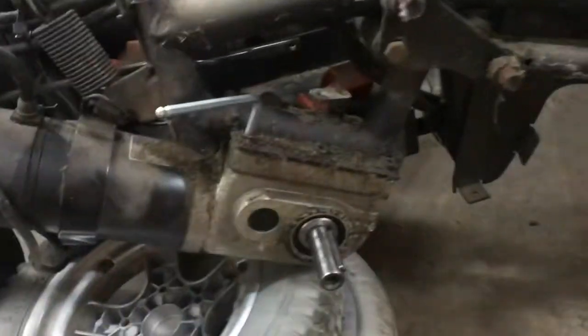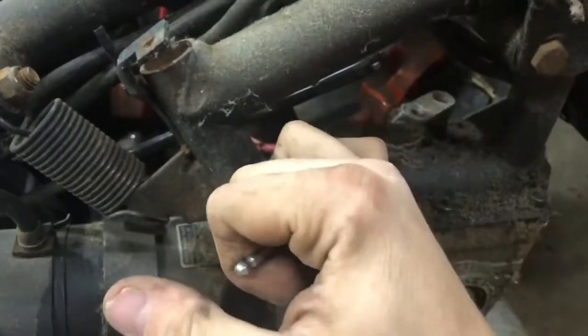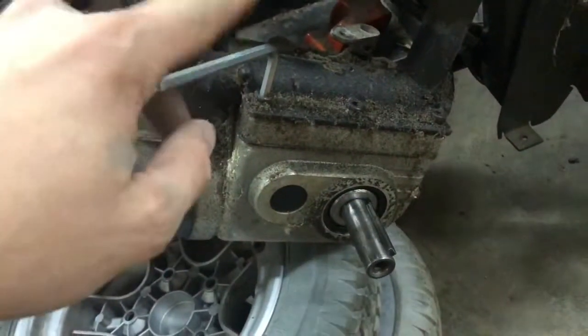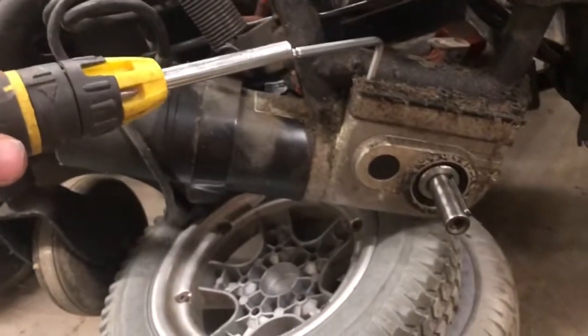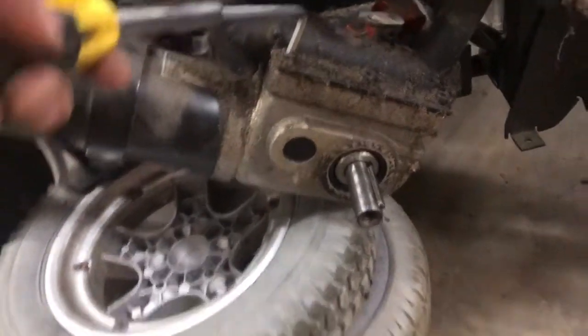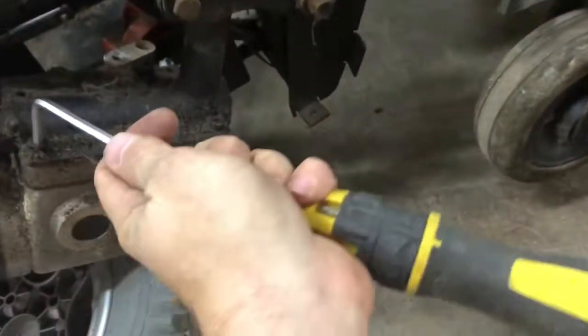So go ahead and start loosening them. You want to just barely loosen, and it's going to take some pressure. So you definitely don't want to hurt yourself, or loosen enough and then bang your hand on something. I've done that too many times. You're going to have to use something like this because you can't use the ones that take a socket, because you can't get behind here. If you have a multi-purpose screwdriver, you can take the bit out and use the other side as leverage. Whoa. And then you do want to put pressure down here. You don't want to mess this part up. And just give it a pull. There you go. Just loosen it a little bit, because you have to loosen all these like a tire.